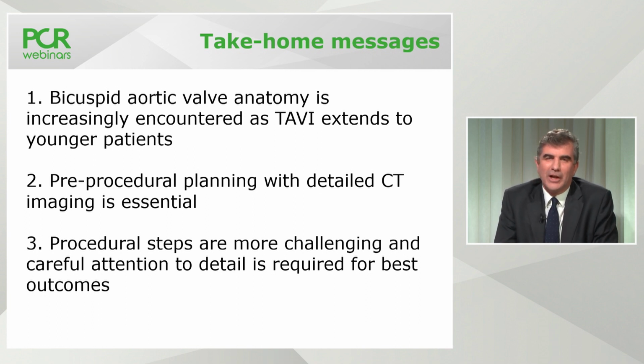The conversations that we've had with Juan have very clearly demonstrated that the CT scan is fundamentally important in demonstrating the bicuspid anatomy in diagnostic terms, but also in providing very sophisticated levels of detail regarding the patterns of fusion, which, as Marcus has told us, will have a direct impact on the planning of your procedure. It also tells us more about the bulk of calcification on the aortic valve leaflets, the potential risks to the coronary arteries at the time of valve implantation, and also, of course, about the ascending aorta. Is there an aneurysm, and may surgery be a better option in some patients?